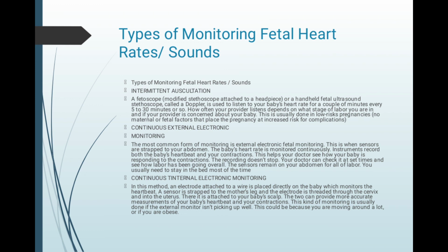This is usually done in low risk pregnancies, with no maternal or fetal factors that place the pregnancy at increased risk for complications.